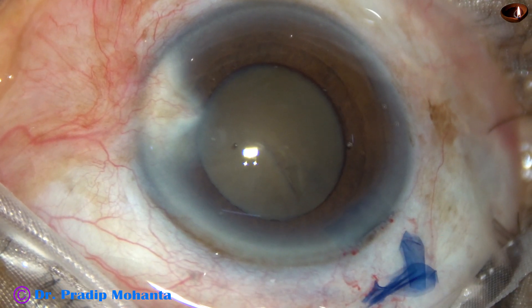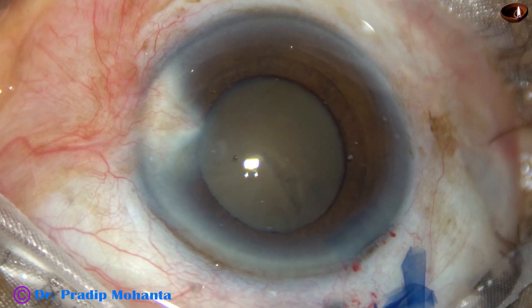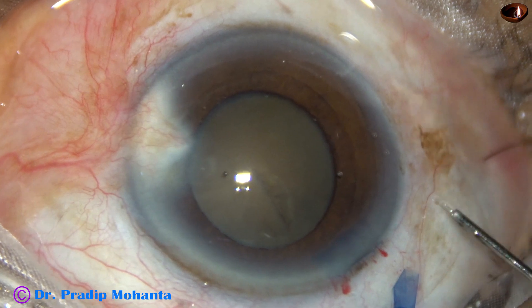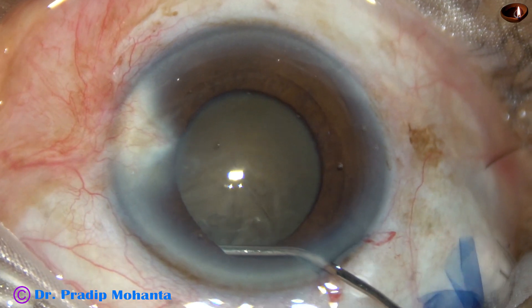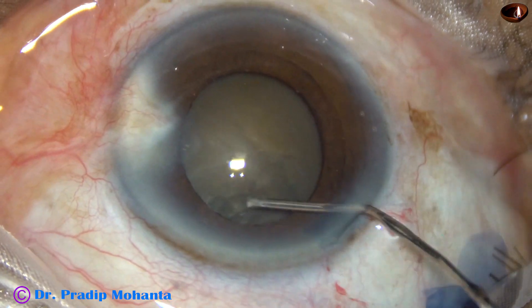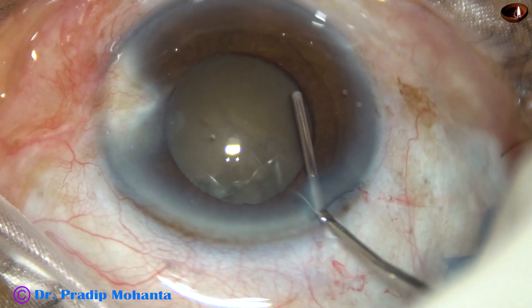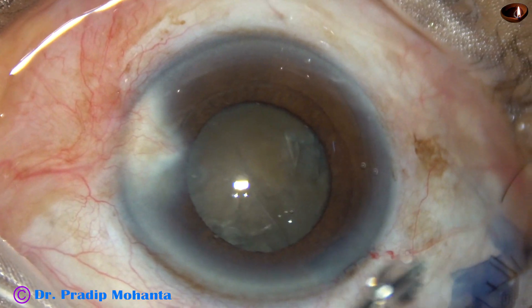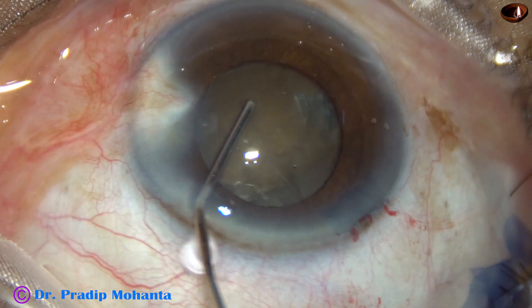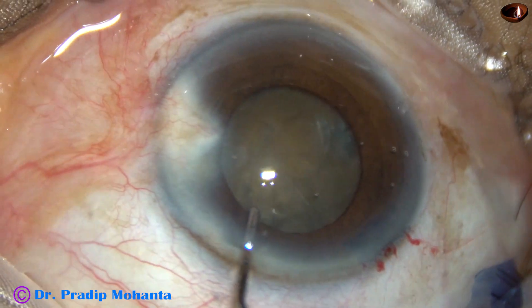You can see this is a hard nucleus — there is no red glow. There is a hard brown or grayish brown nucleus. A very small amount of fluid is injected, and now the nucleus is rotated.